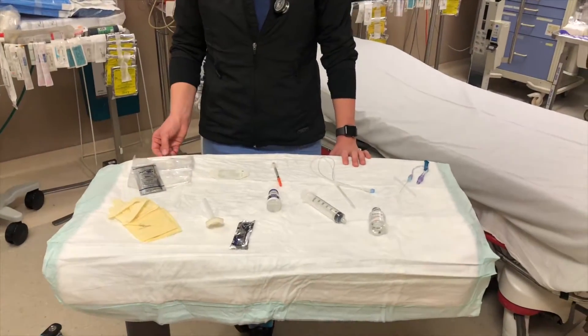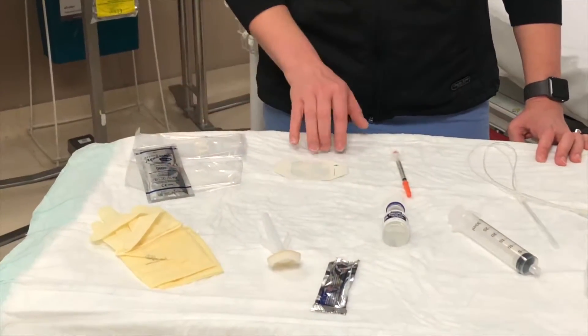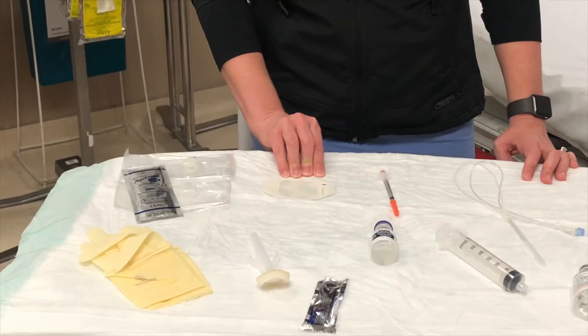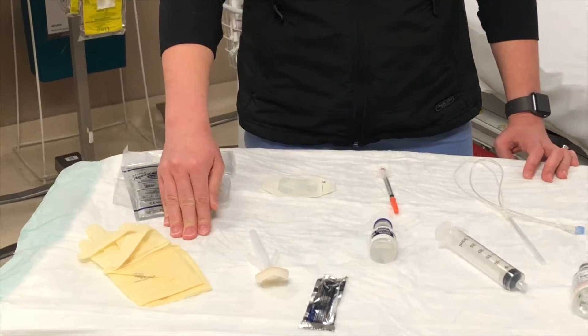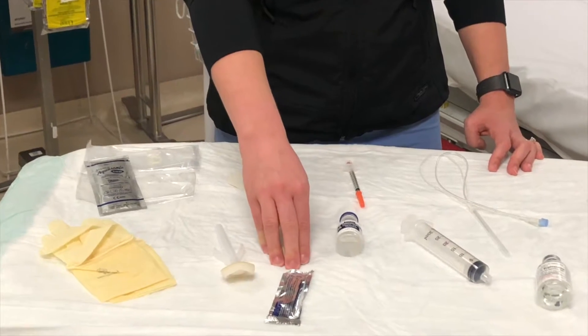First, we're going to gather our supplies. We do this procedure sterilely, so you'll need a sterile ultrasound probe cover. Alternatively, you can use a Tegaderm over the probe cover. Grab some sterile gloves, chlorhexidine or other cleaning solution for the patient's skin, and sterile gel.